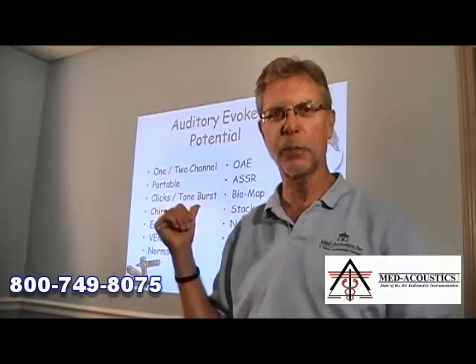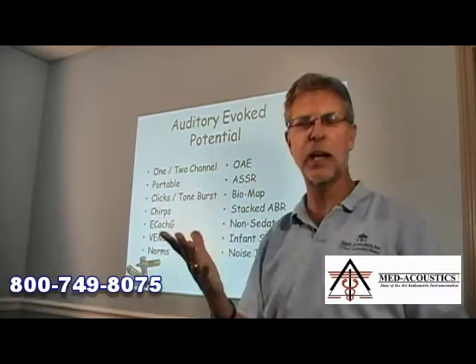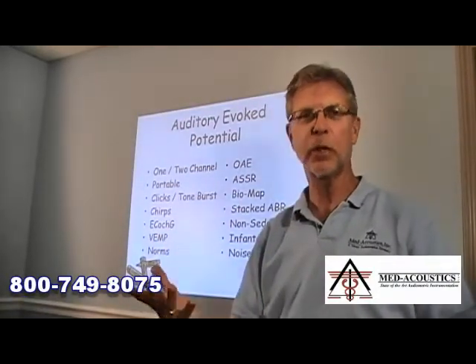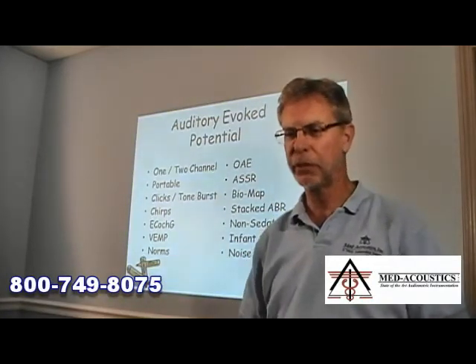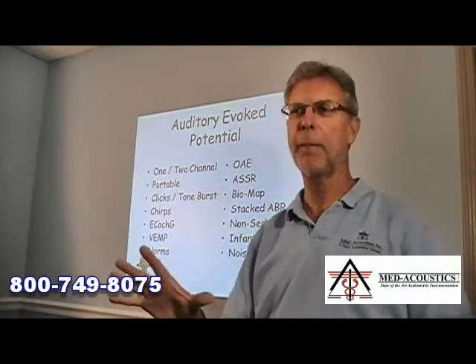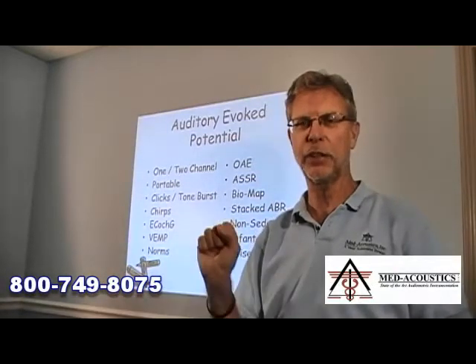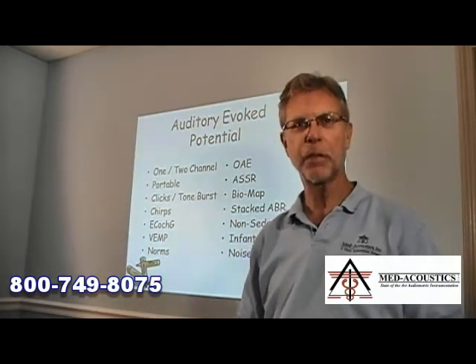And so that's why I started with this slide, because it kind of gives us the questions that we have to ask before we can begin to look at what's out there and what would be the best for our particular facility. And what we will end up doing is focusing on the Interacoustics Eclipse, okay? And I'll give you a demonstration of that, point out some of its features and benefits, and compare it with the other systems. Fair enough?